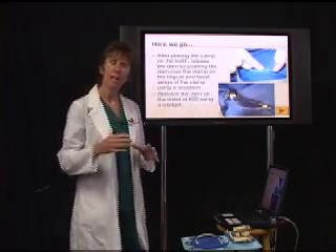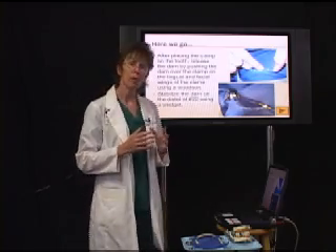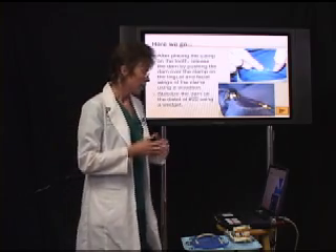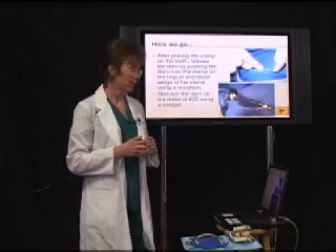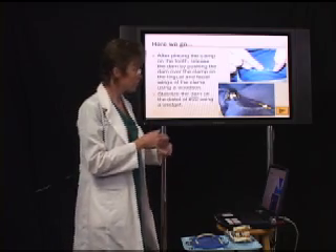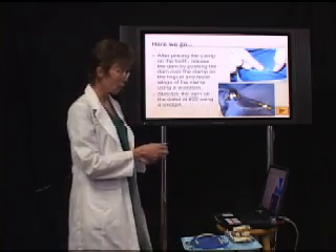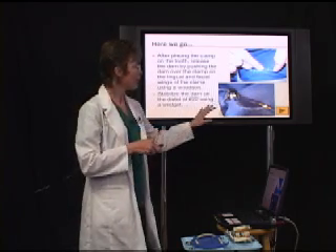Now you have the dam engaged on tooth number 31. If you're doing this by yourself — and in most cases you will be — after you place your clamp, stabilize the dam by flossing the opposing end, which in this case is tooth number 22. Floss the distal of number 22, then use a little piece of rubber band-like material called a wedget, and floss that on the distal of 22 right there. Now the dam is stabilized.